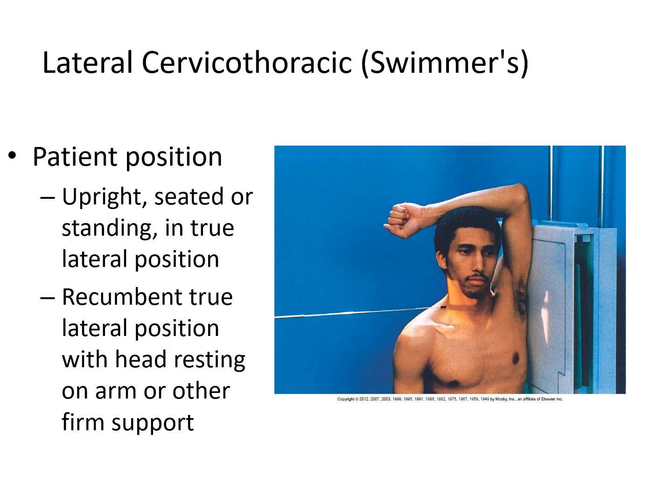Okay? You can do it upright. You can also do it supine, lateral, or recumbent. I've done both. Okay? The near side arm, the side closest to the image receptor, which is typically the left, is the arm that raises, that goes superior. Okay?